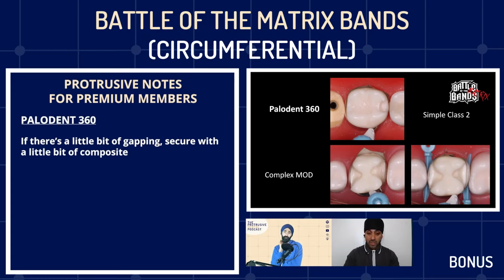So I think this is actually quite cool, right? Out of the ones you've shown me so far, this does look like the best in terms of the same cavities that you've shown us. This one so far looks pretty decent, but you have to use these specialized wedges to get that result. So the price suddenly escalates a lot with these plastic wedges.